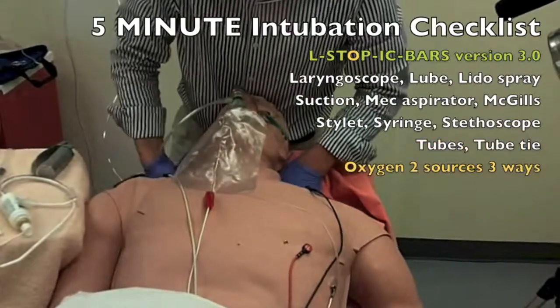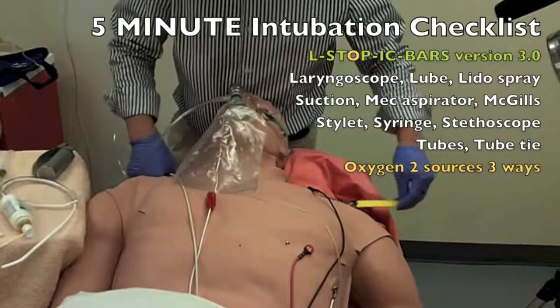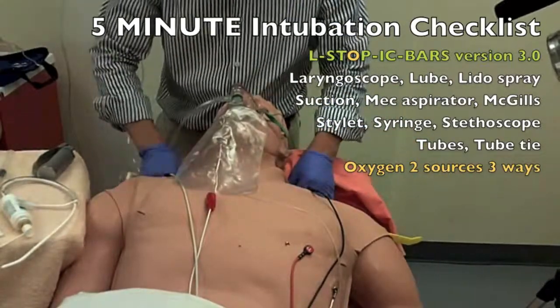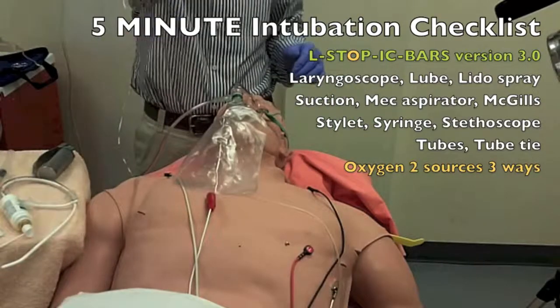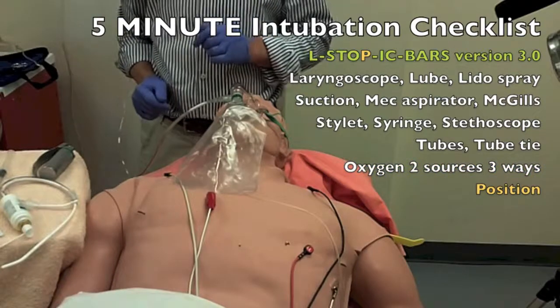We have oxygen, we have nasal prongs in, yep. Plus we have a full face mask. So oxygen, two sources, three ways. We've denitrogenated the patient. We've got apneic oxygenation going. We've reoxygenated to 100% there. Check.